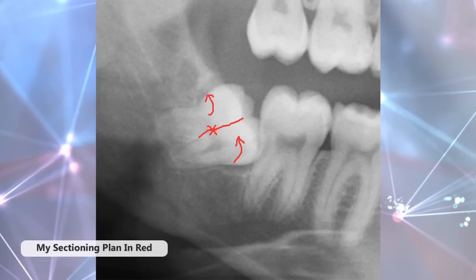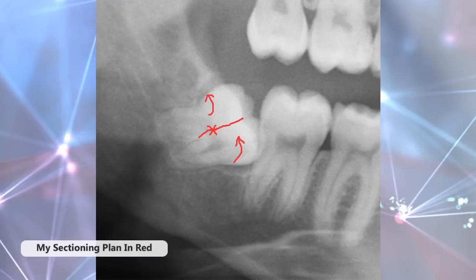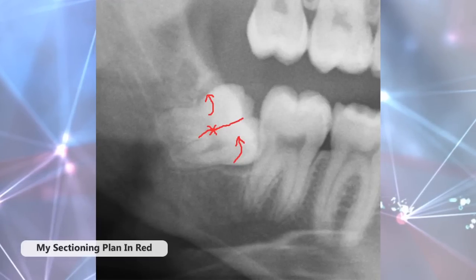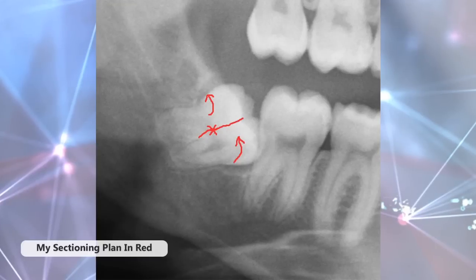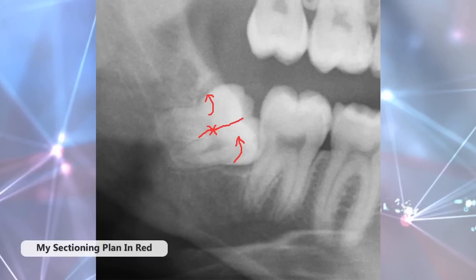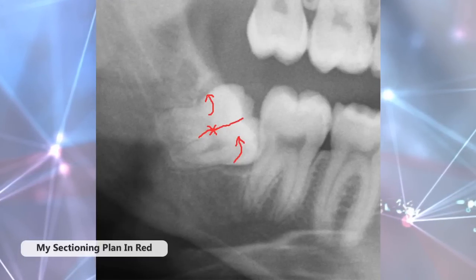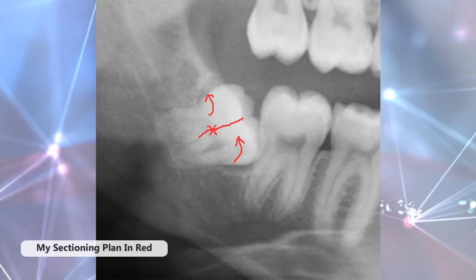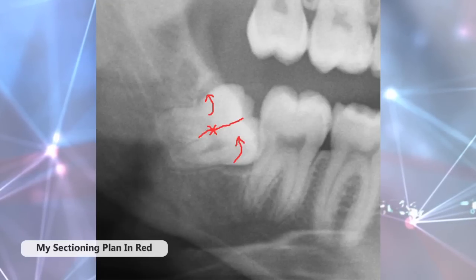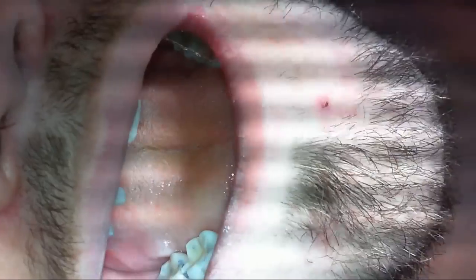This tells me where my bur is in relation to the tooth. As you can see, removing some of the distal cortical bone makes elevation of the distal part of the crown and root very easy. I'm going to share some tips along the way.